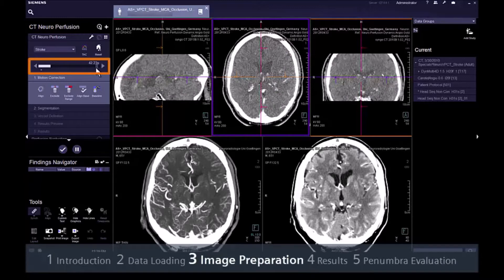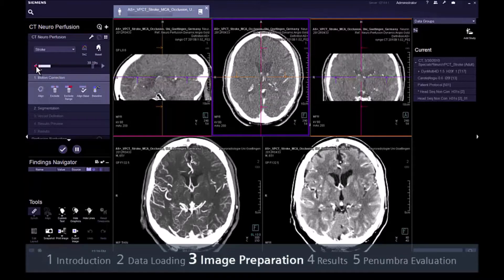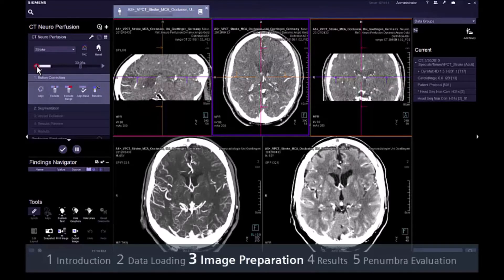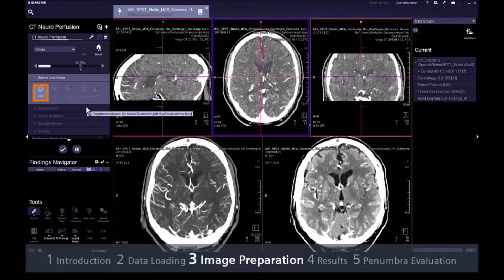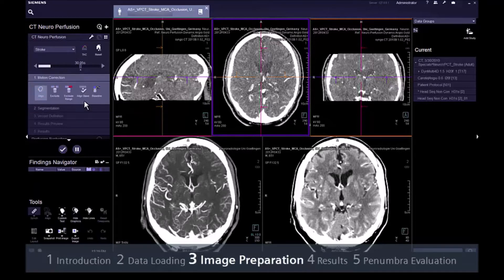The first step of our workflow allows motion correction. Just scroll through all time points to detect a good time point with minimal motion that could be set as a reference. Notice how the small triangle changes and apply motion correction. If motion artefacts are observed in some time points, it is better to remove the corresponding points beforehand.